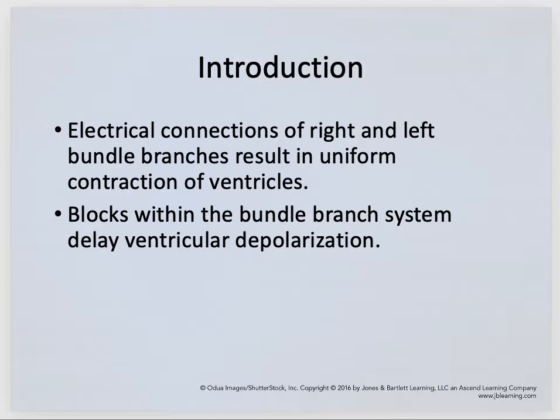So let's first take a look at the left. So bundle branch blocks, without me even telling you, I'm going to let you know that we're looking at the QRS. So let me just go back. Last week's AV blocks: first degree, second degree, either Wenckebach or Mobitz type 2, and third degree. All of those, you're looking at the PR interval. Now I've got the same terminology, block, but now I'm talking about a bundle branch block. So now we're a little further down in the heart, into the ventricles, left or right His bundle branch. So when you take a look at a bundle branch block, guys, your eyes, your mind is focused on the QRS.